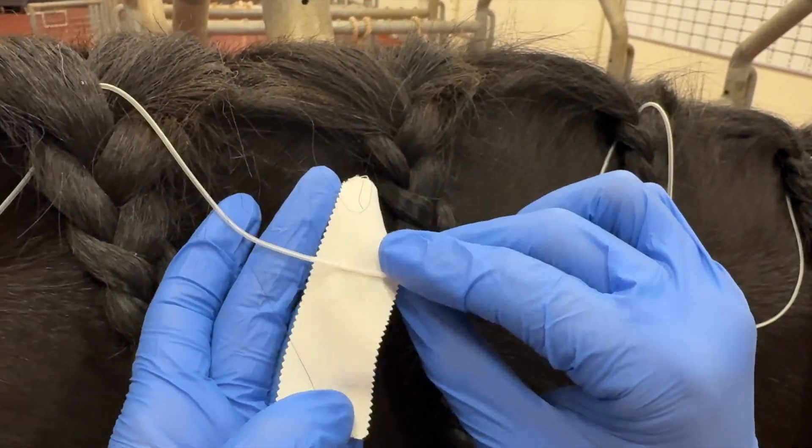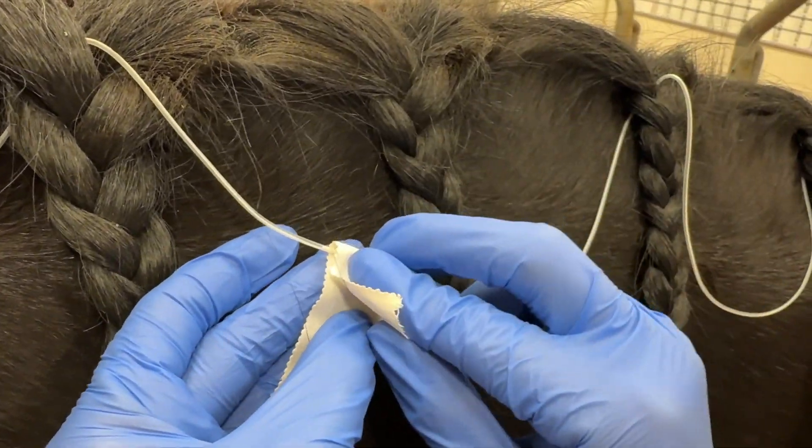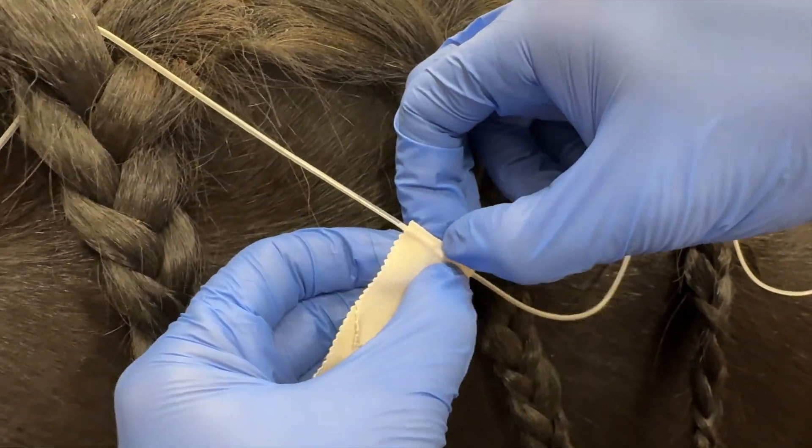The tape does not have to be anything specific, just in order for it to not slip off. Tape it around with any surgical or even duct tape.